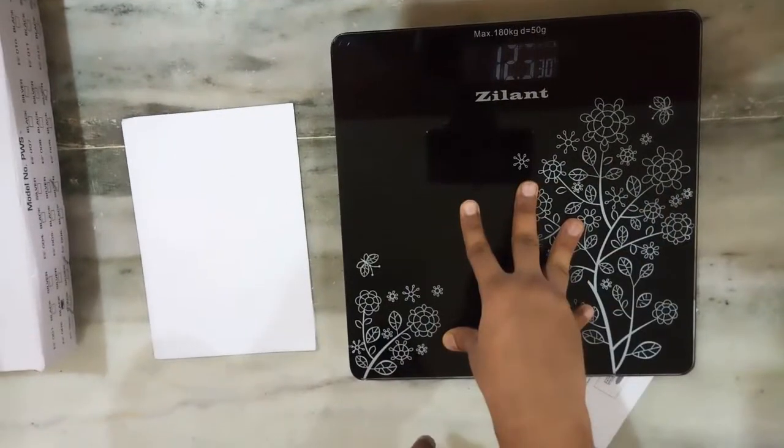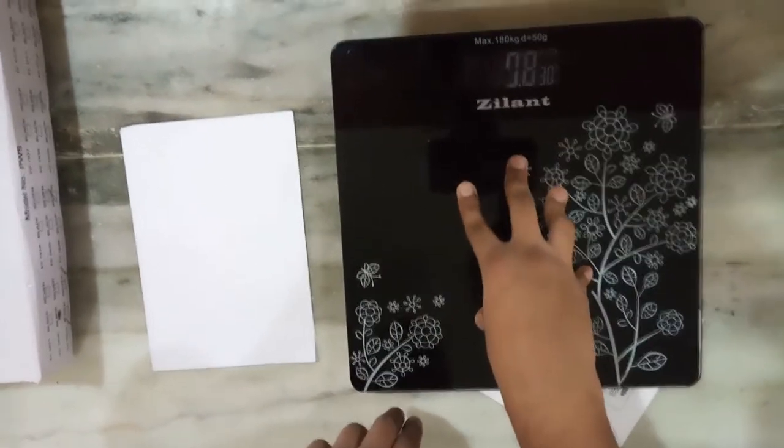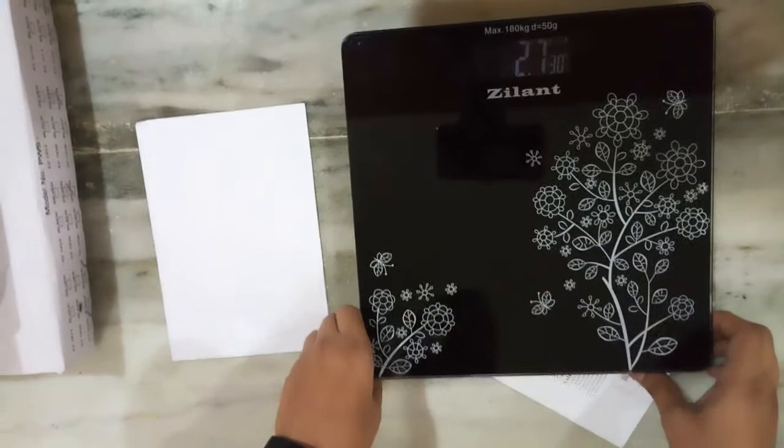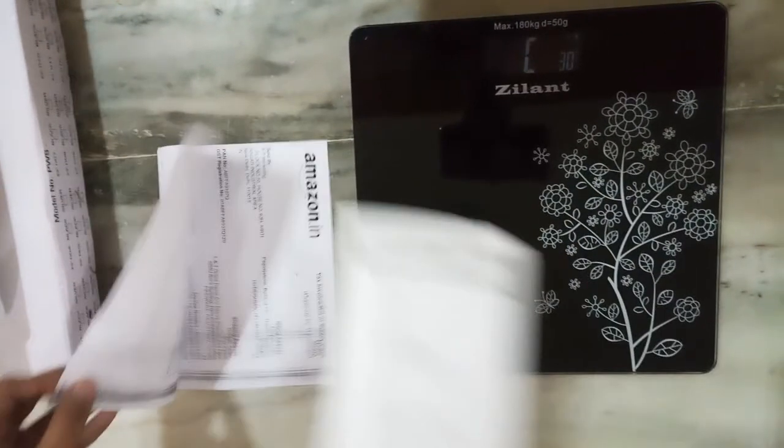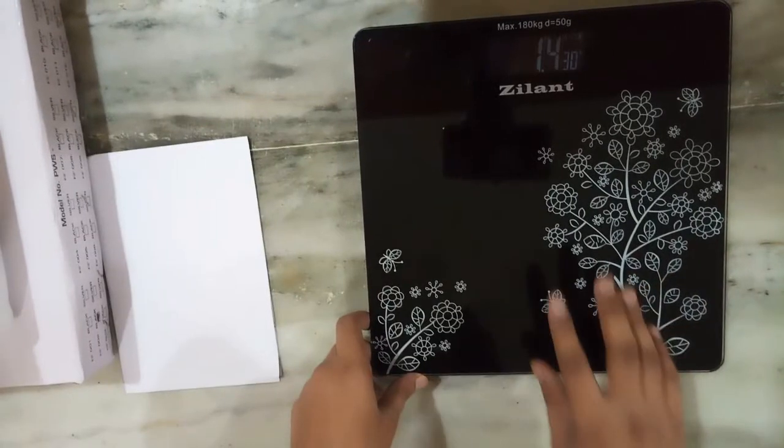The weighing machine is very good and also very accurate. It records very minute differences also. So I would recommend to you to buy this machine.